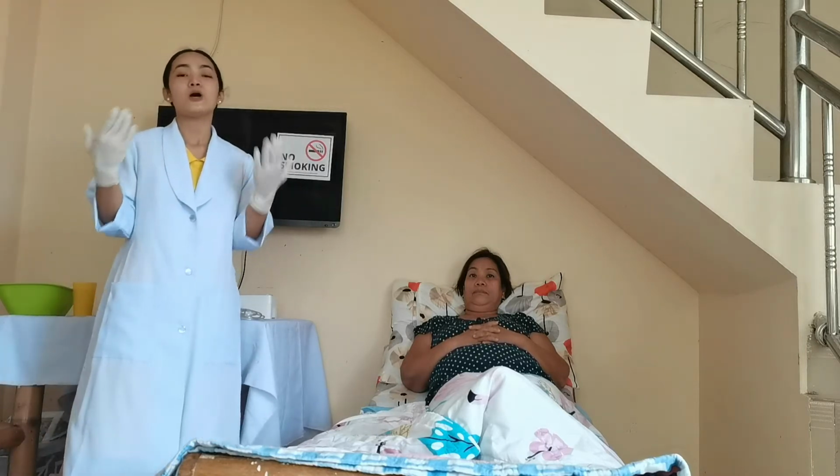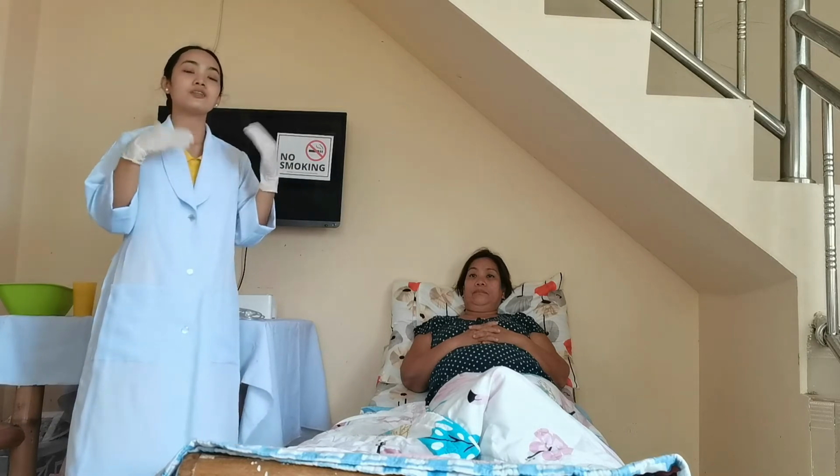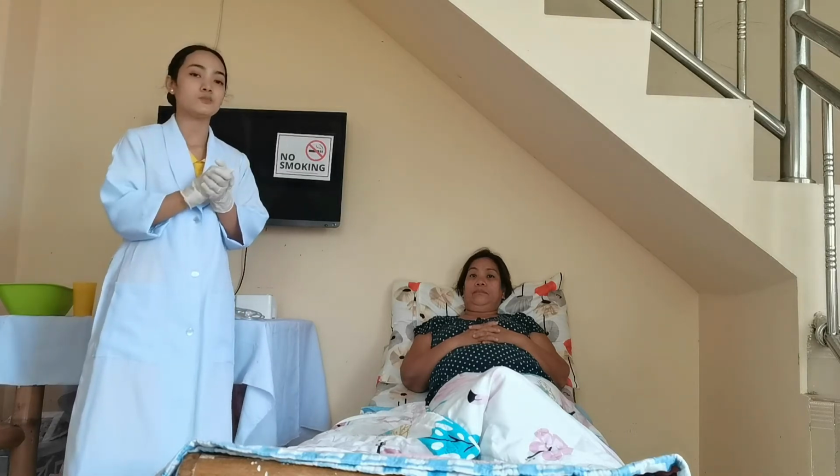So once we are done, we are now going to position the client into a semi-Fowler's or high Fowler's position.